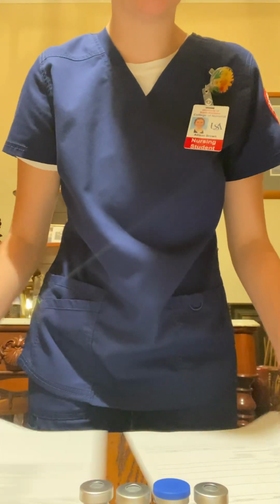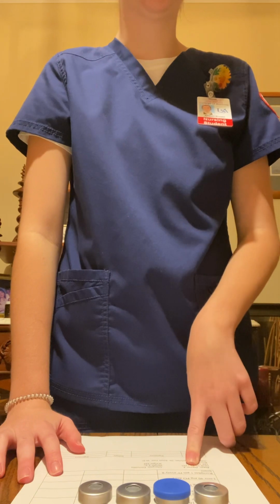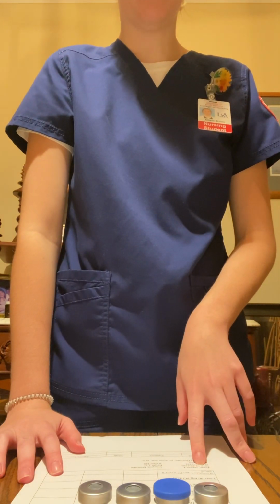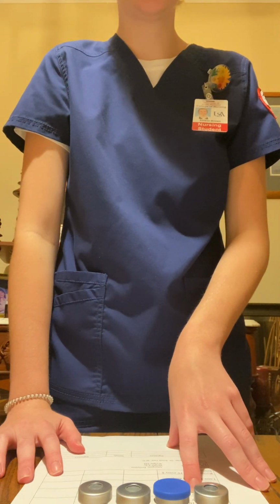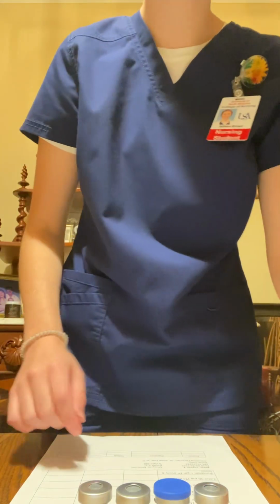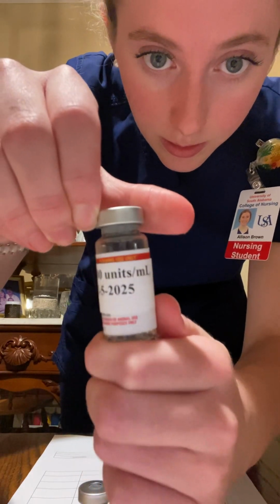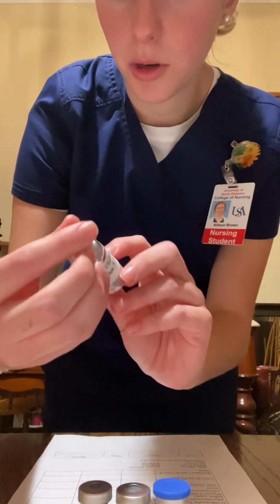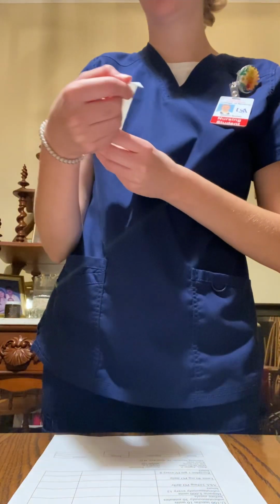So I'm just going to use my MAR. For my patient again, I have Jaguar J. Jones, and my medication is heparin, and the dosage is 5,000 units, and it's subcutaneously. So I'm going to pick out heparin, and the expiration date is 12/5/2025, so we're in date. I'm going to set these other ones to the side. And since it is subcutaneous, I'll be using a 28 gauge 1/2" needle, which is that.